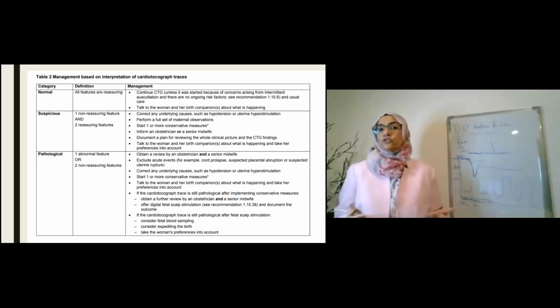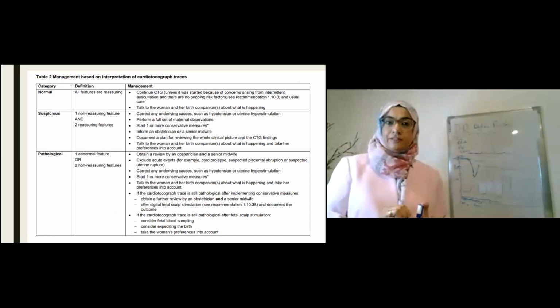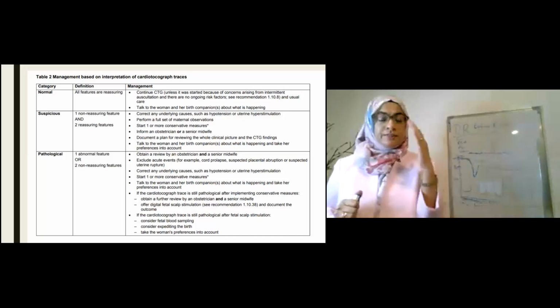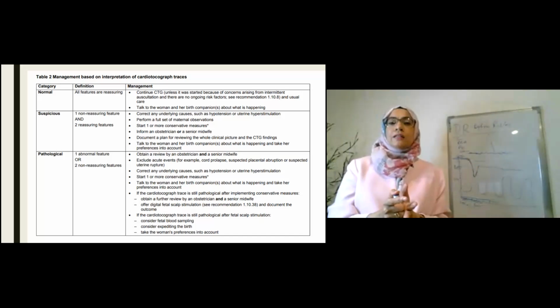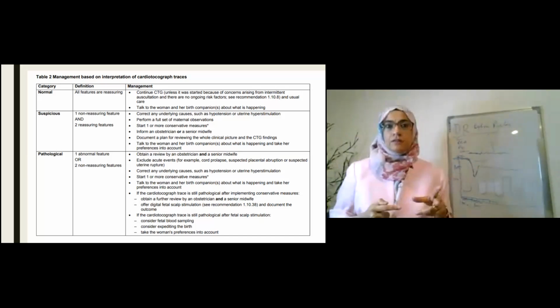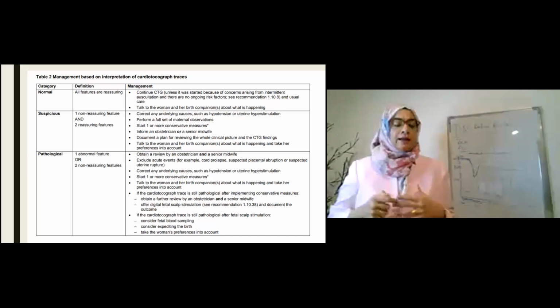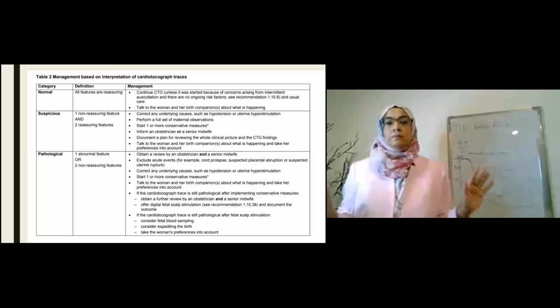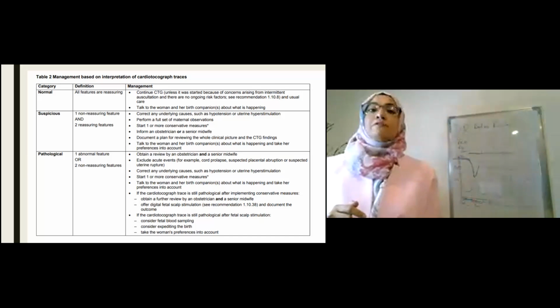And there are only 2 things that you can do in a pathological CTG. Always remember, once you have classified it, now you're an expert, you know your DR C BRAVADO, you know your definitions, you know your green, amber, and red boxes, you know the features, you put it there and say, oh my God, that's a pathological CTG. Only 2 things you can do in a pathological CTG. You get it better by changing the position of the woman. You can give her some fluids, you turn her around, and these are certain measures that we do, and it should get better. Better means it should become normal. If it doesn't get normal, you have to go and do a fetal blood sample.